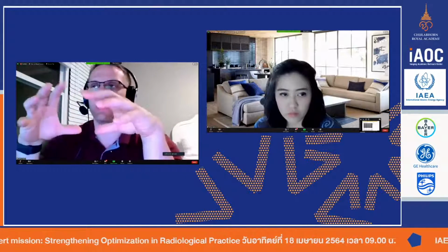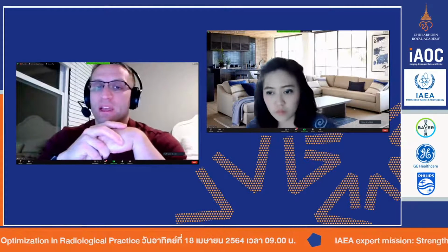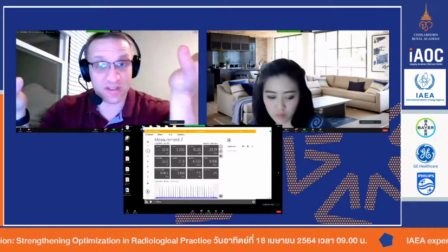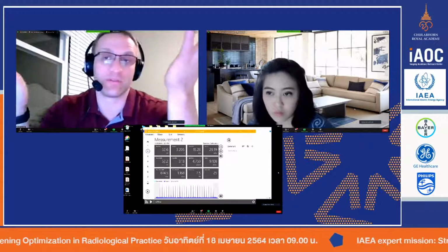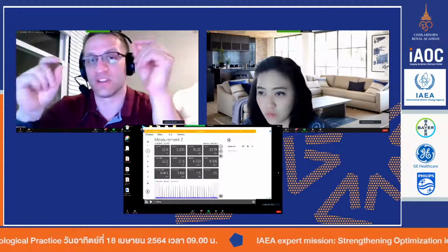There's always going to be a service mode or an admin mode. And there should be someone in your department, usually a technologist, that is the lead technologist. So they will have that passcode and you can get in and you can see, and there's so many options. And so I always recommend that you work with your app specialists for, let's say you have a Philips unit or a Canon Toshiba unit.